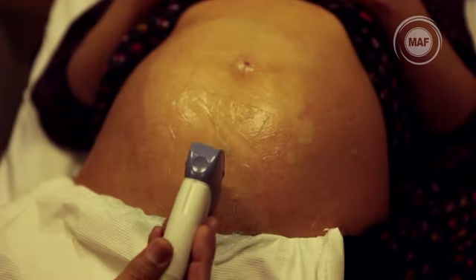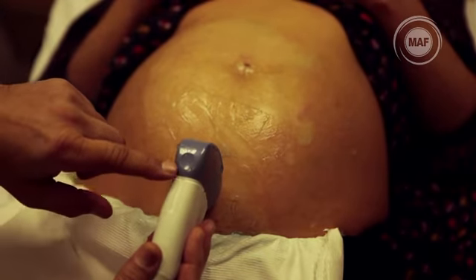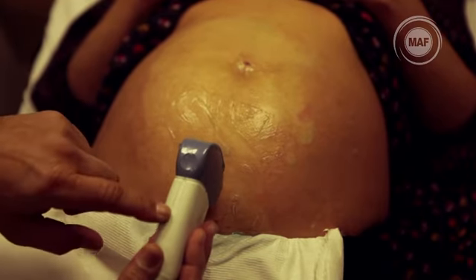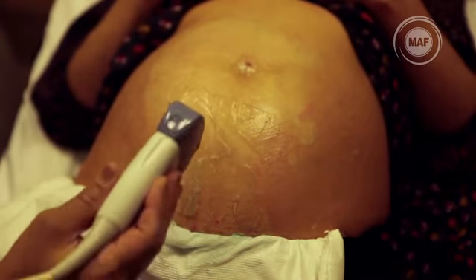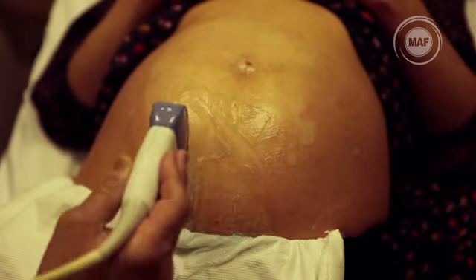So, every transducer or probe will have some sort of a marking, a groove, a dot, a little light, that could tell you what the correct orientation should be. On here, you see a little groove and a dot. There's nothing on the other side. Okay? So always start off your obstetric scan in the longitudinal section.